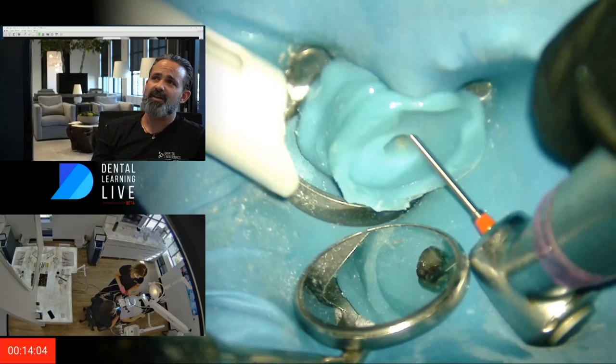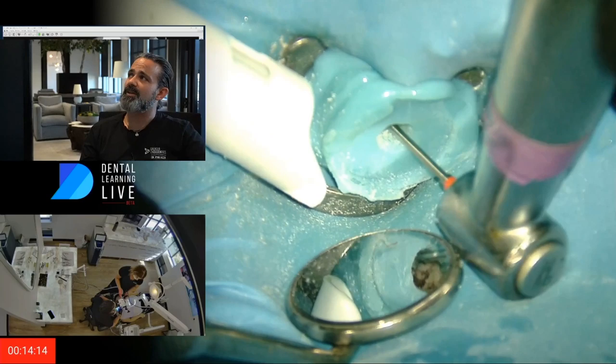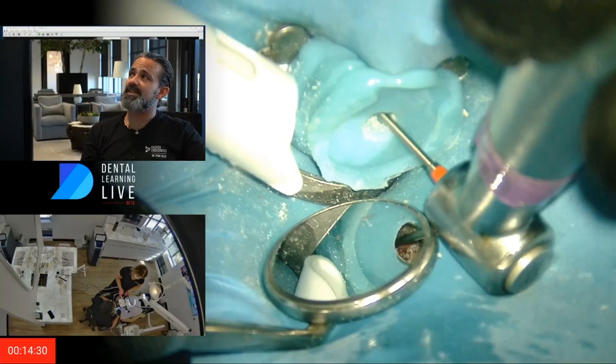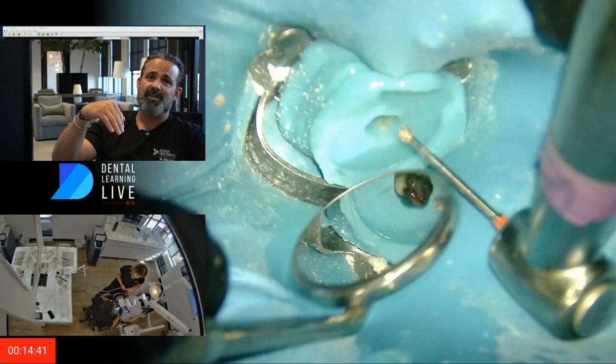I'm taking a round bur to get the feel where it drops in, so I don't get a little crazy with my high speed. I just dimpled it, found the chamber, felt that little relief zone — it dropped in. From there I finesse out with a traditional diamond access bur, which I prefer. So now it's just very familiar territory and it only takes a couple of minutes. I'm going after these pulp stones with a round bur — it's the instrument of choice for me. I've pendulum-swung: did round burs, went to ultrasonics, and now I'm back to Munce burs. I remember from my CBCT that I had connections between my orifices.